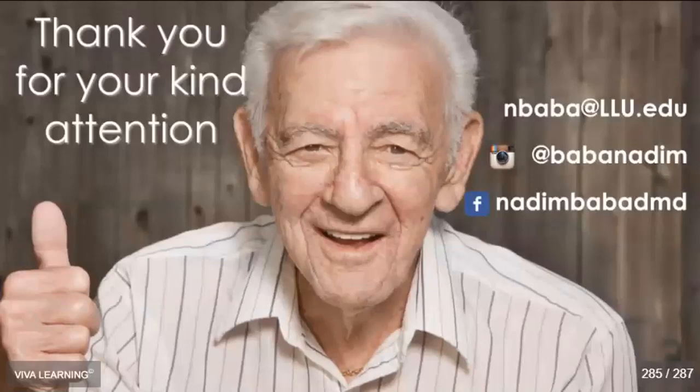Another question is, how is the posterior palatal seal developed? Excellent question. Because the milled material does not shrink, it has pre-shrunk. It's a block of PMMA material that is pre-shrunk, and it's under 5-6 bars of pressure, so it's a very hard material. The material does not shrink, so there's no need to create a posterior palatal seal. Conventionally, with the analog dentures, the reason why we had posterior palatal seals is because you wanted to compensate for the shrinkage of the material. And that's why we had the posterior palatal seal or the post dam, just to close that area and seal it. But with the milled dentures, you don't need that.